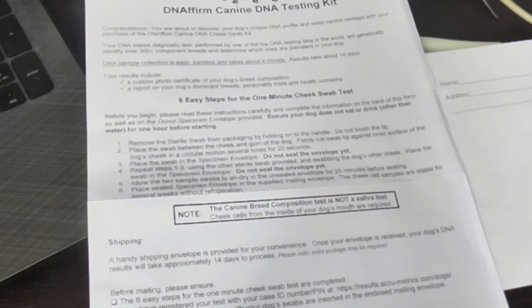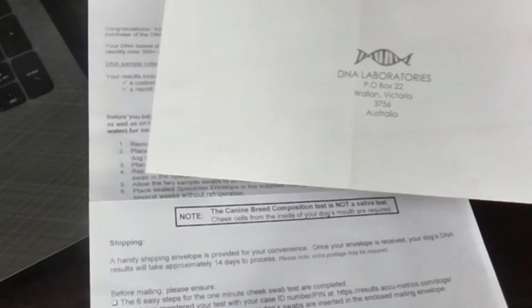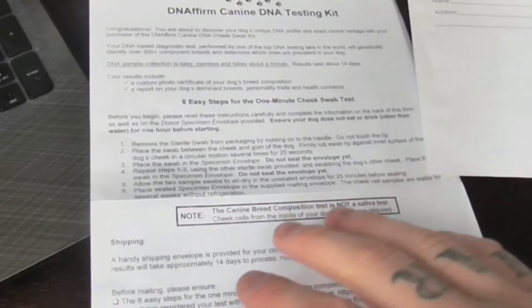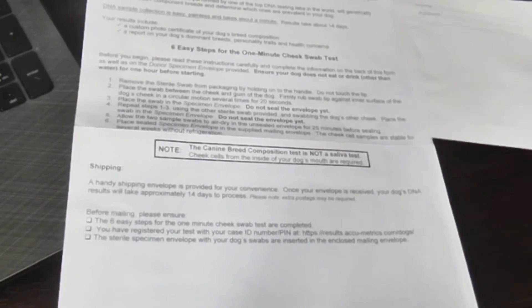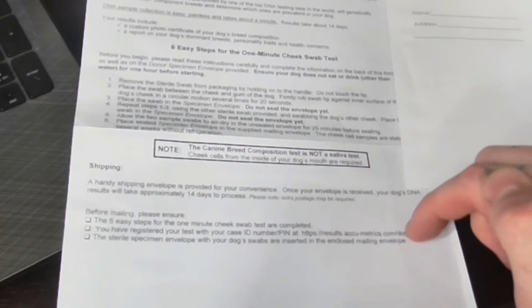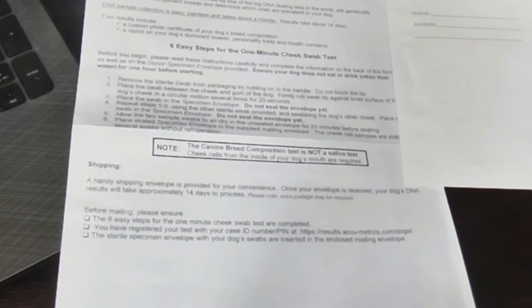Then you place it in this envelope and wait 25 minutes for it to dry out a bit before you seal the envelope and ship it back. Apparently within 14 days is how long it'll take to process and find out the results — they'll email them to you. You also have to go to their website and register your case ID number, which they give you a card for and also put on the sheet.